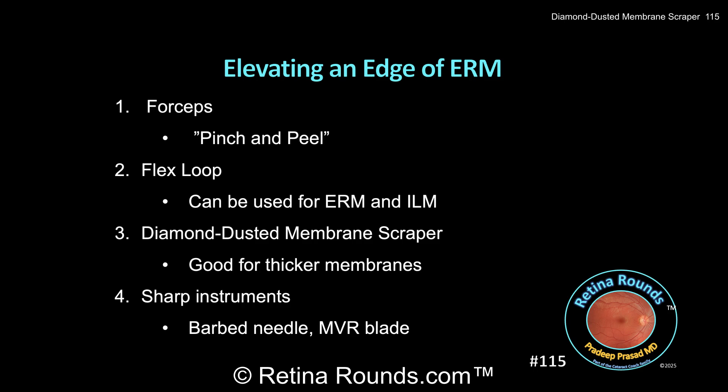Here are some points for discussion. There are a number of ways to fracture and elevate an edge of ERM, and we will show examples of these different techniques in future videos. I find that simply using the forceps to pinch and elevate an edge of ERM works for the vast majority of cases. In this so-called pinch and peel technique, grasping forceps are used to gently engage an edge of the ERM.